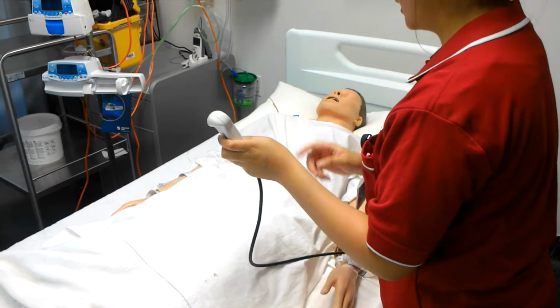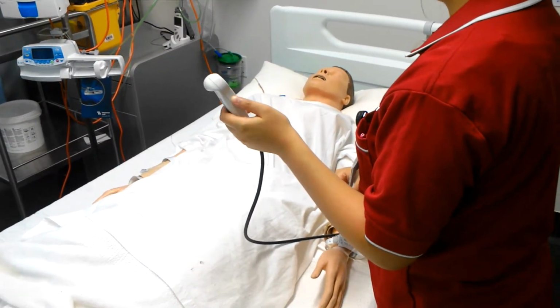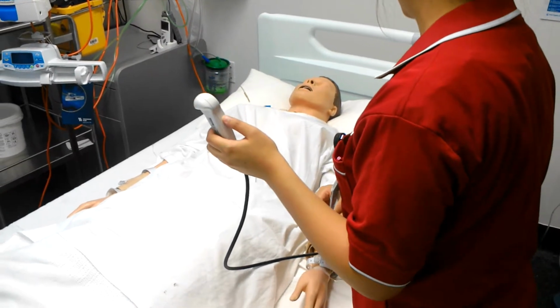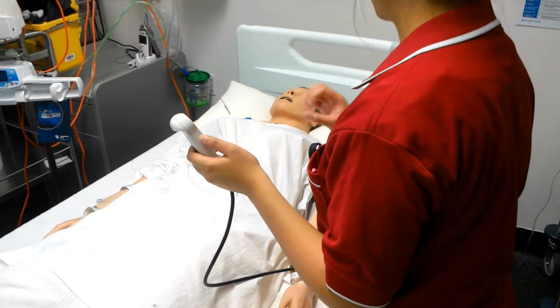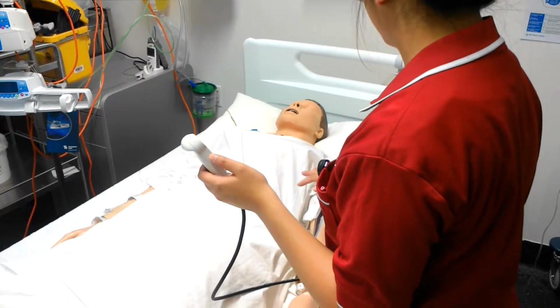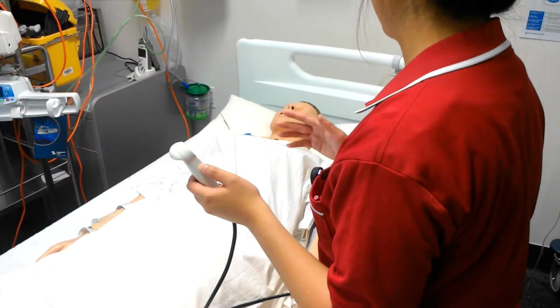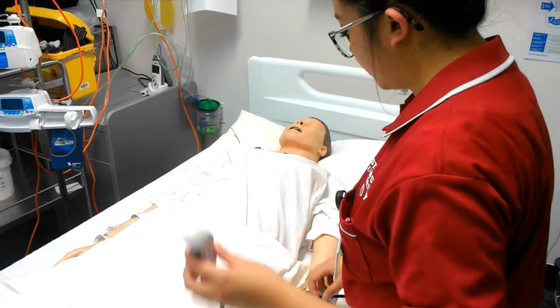Once you see that the button flashes a solid green, that means you can press it for another dose of medication or pain relief. If you see it flashing green, that indicates that the medication is going through. Now, there's a lockout period of around 5 minutes, so it'll let you know when you can press it or not. Do you want to have a try?